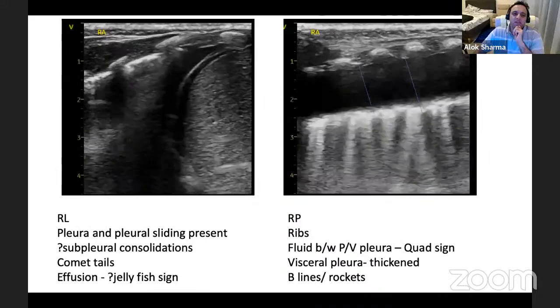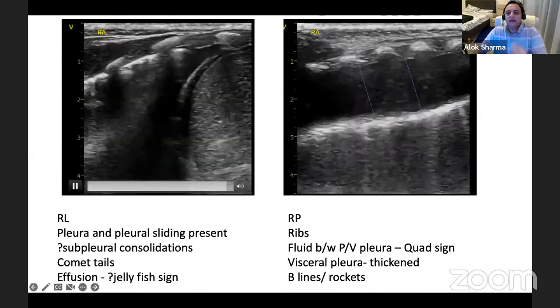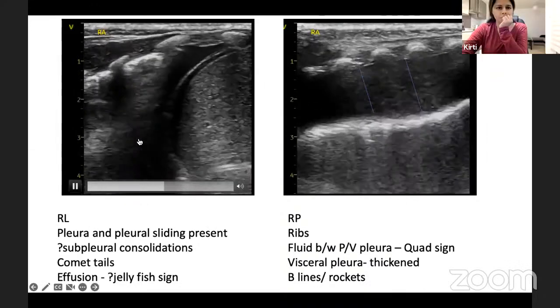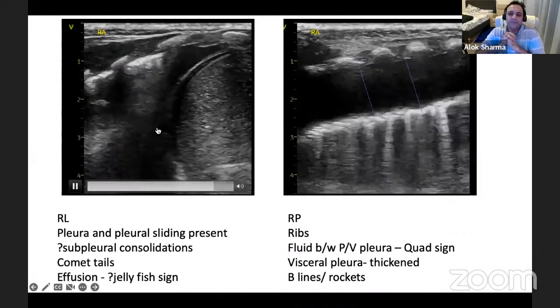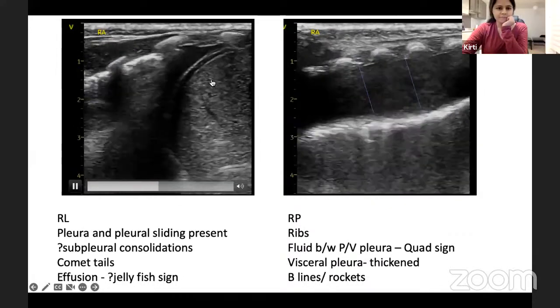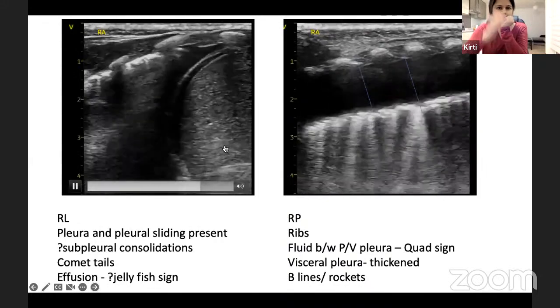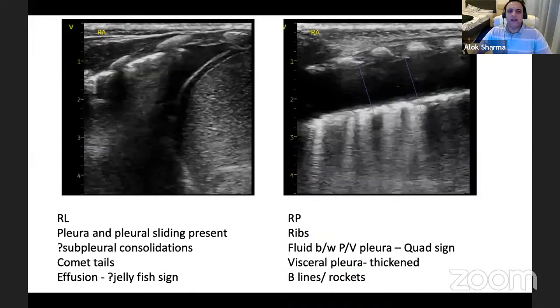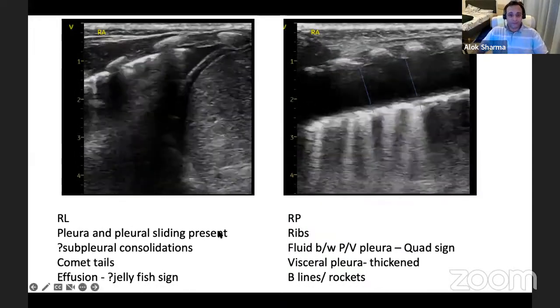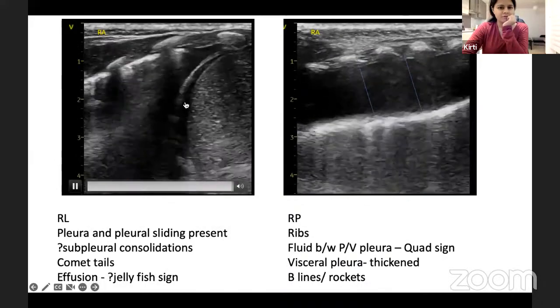But what you don't see is the plankton sign, which is kind of debris within the pleural fluid. Okay. And then what else do you see? Would you like to describe other things below the lung? So this here is the diaphragm and this here is the liver. Okay, very nice. So you have the diaphragm and anything below the diaphragm? Is this what you're referring to? Correct.